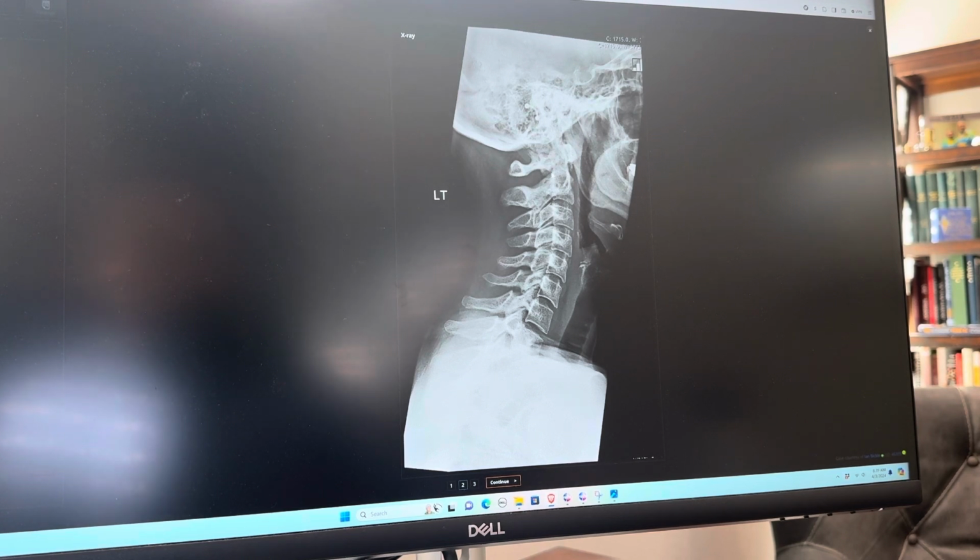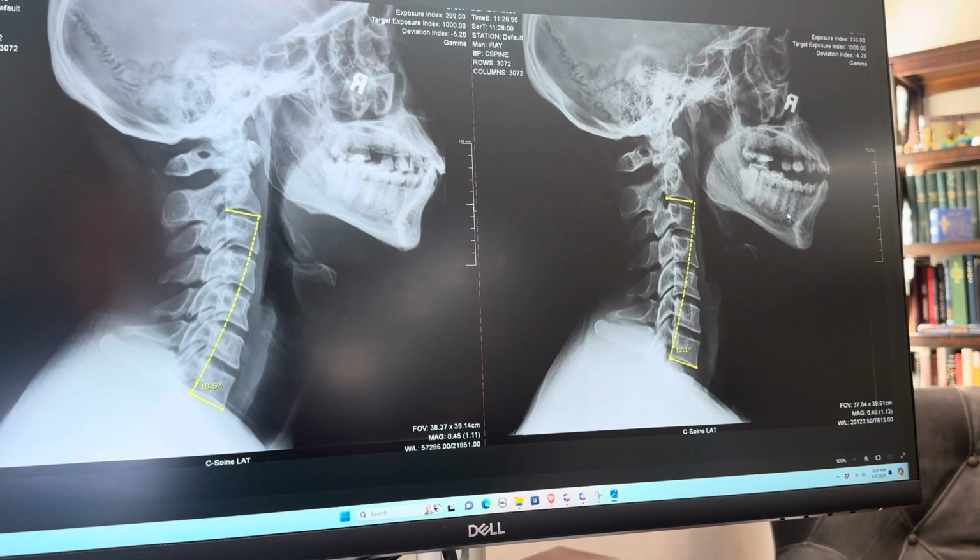So now the question becomes, well, doc, how often do we check this out? Well, in my case, I like to shoot films pretty much once every, I would tell you, we shoot them probably every 6 weeks, every 9 weeks, somewhere in that range.